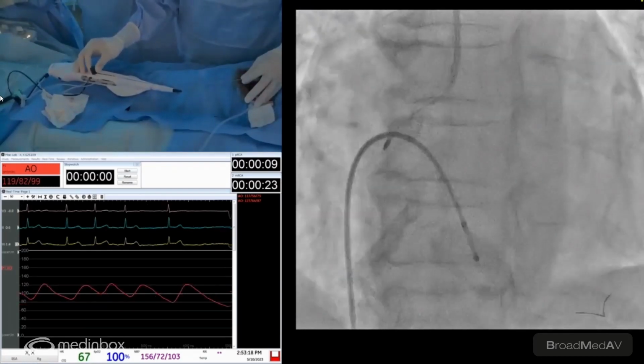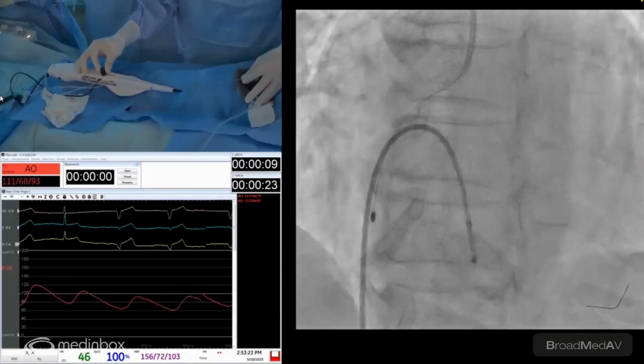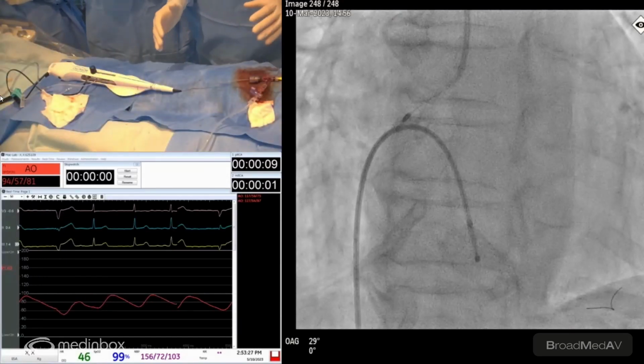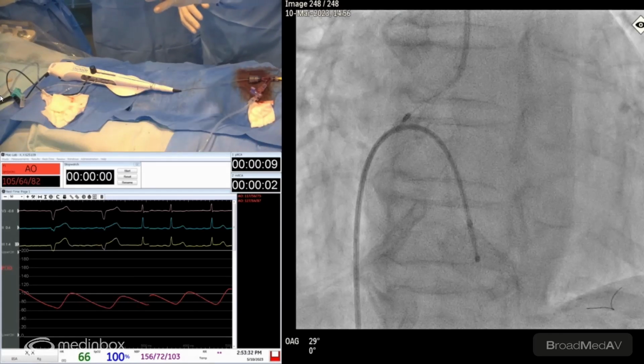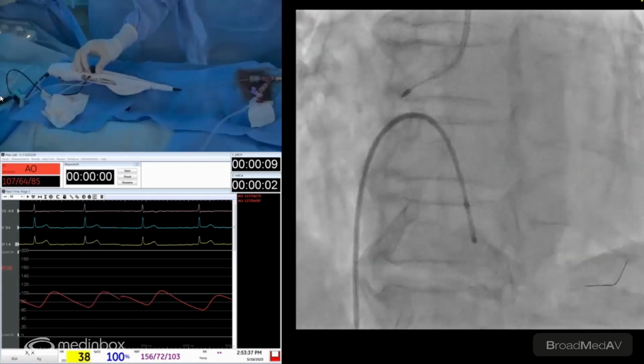Very nice. See, there was something there at the curve and it jumped a little bit. Yeah, very nice. But we're okay now. Very smooth. You need to make sure you cover the whole lesion, because if you do just proximal and you miss a little bit distally, you might run into trouble with balloons afterwards. So we'll do one final polish run.